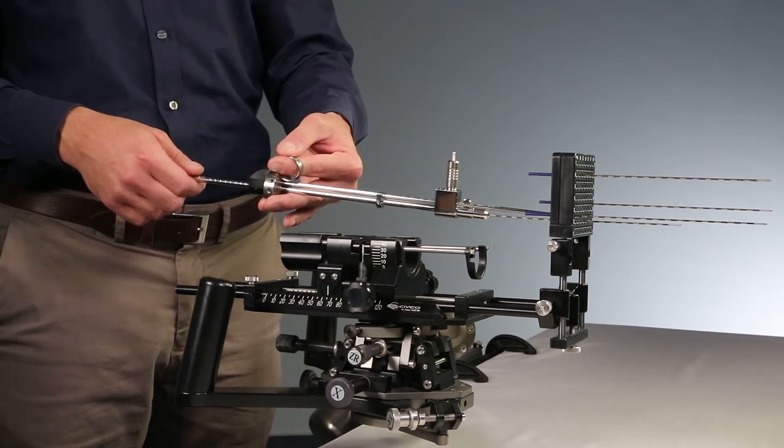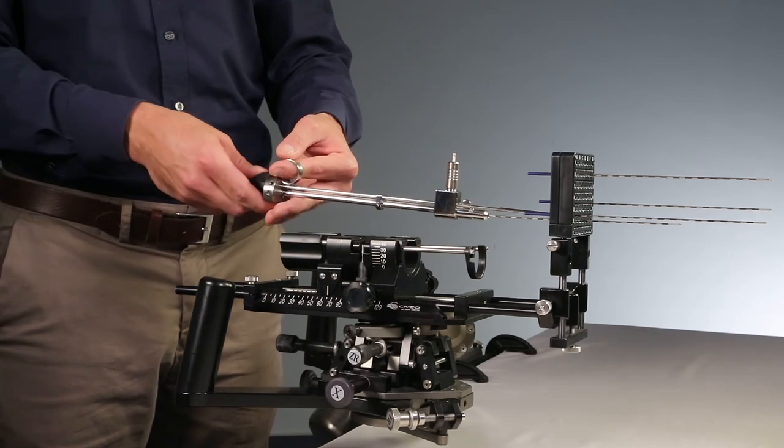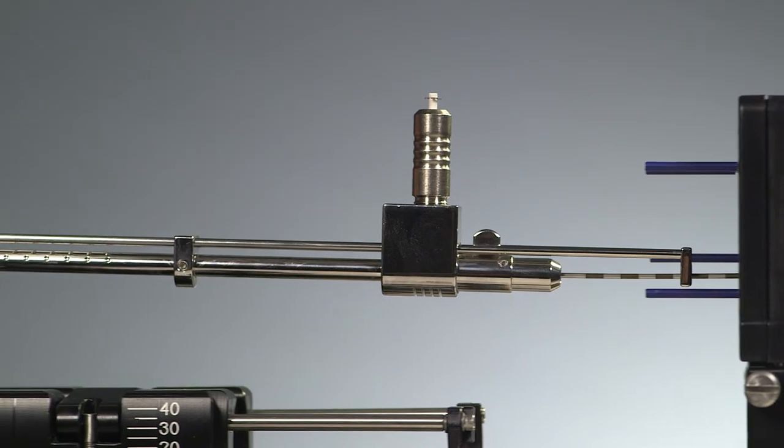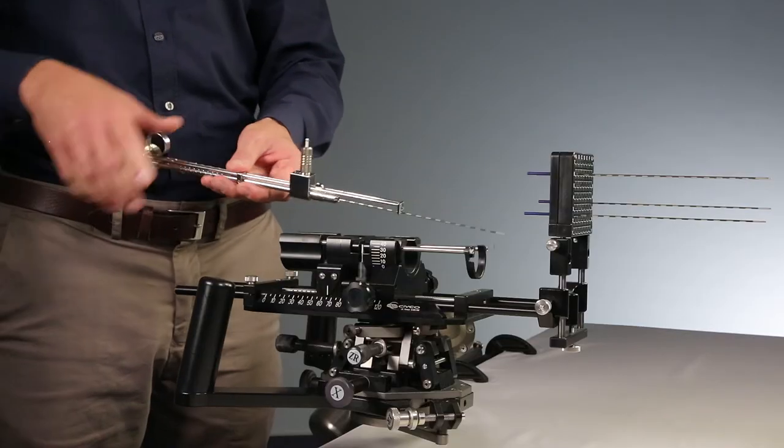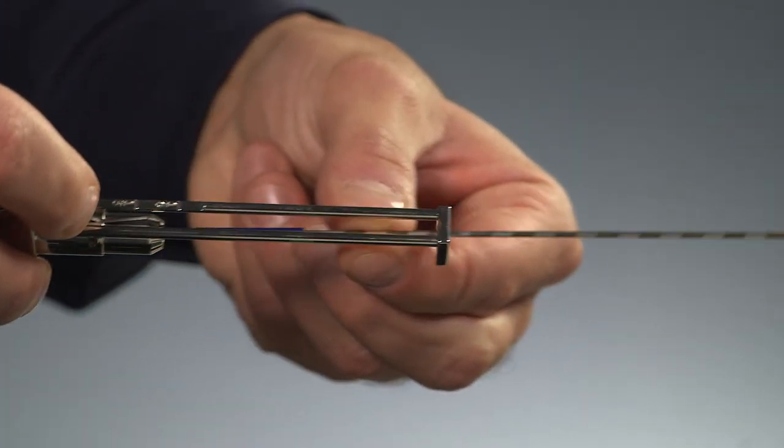Once the number of seeds per needle are placed, pull the applicator with the needle out of the template and disconnect the needle from the applicator.